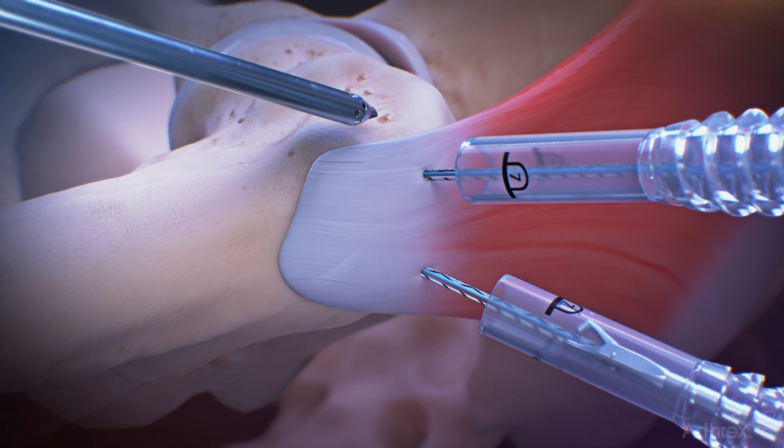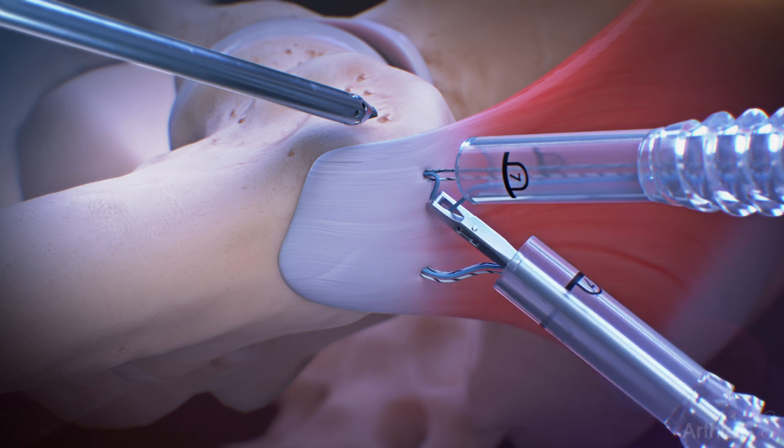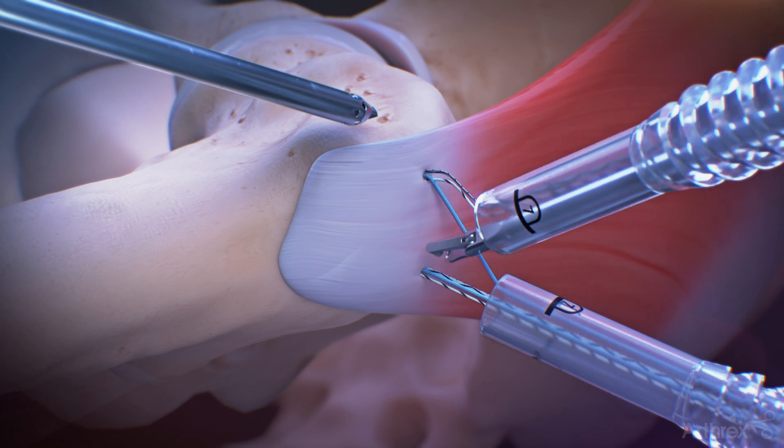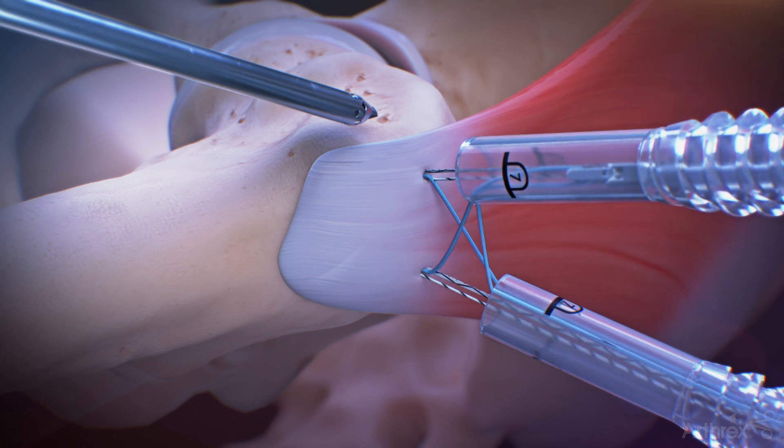Once both anchors have been implanted, retrieve the blue repair suture from the anterior anchor through the posterior lateral cannula, and the blue repair suture from the posterior anchor through the anterior lateral cannula.